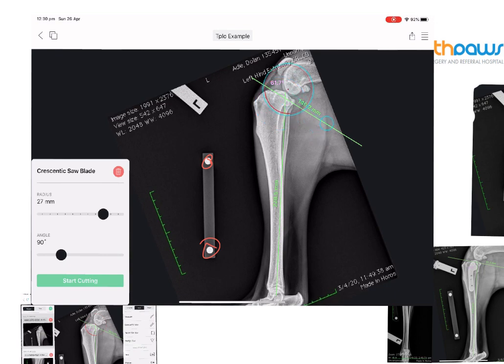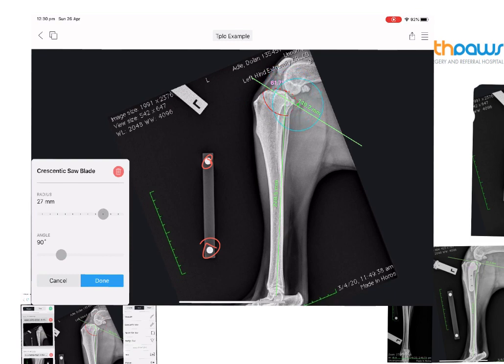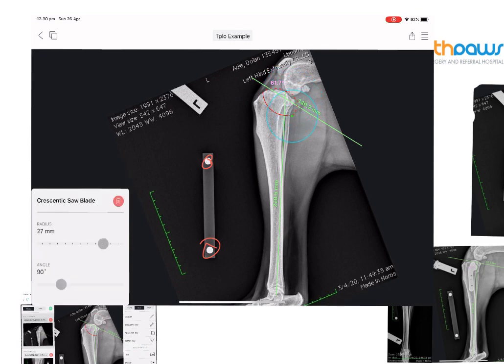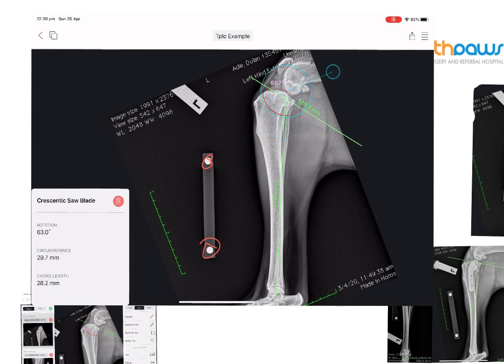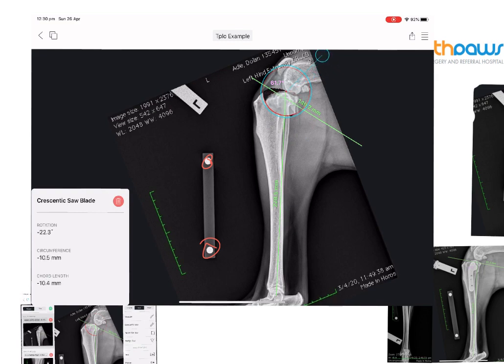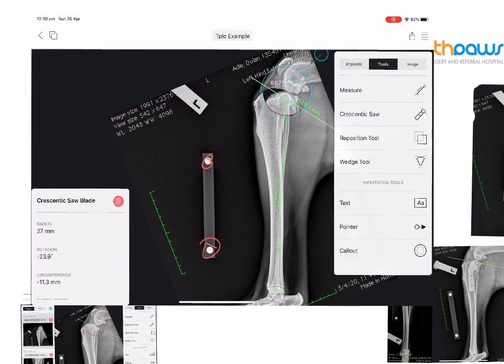We're selecting a 27 millimeter saw blade for this particular patient. Once we've done that, the program cuts out a section of bone. We can then rotate that piece of bone — we have an angle of 28.3 degrees so we're going to rotate by about 25 degrees — into the new position, ending up with a post-operative tibial plateau angle of about four or five degrees ideally.